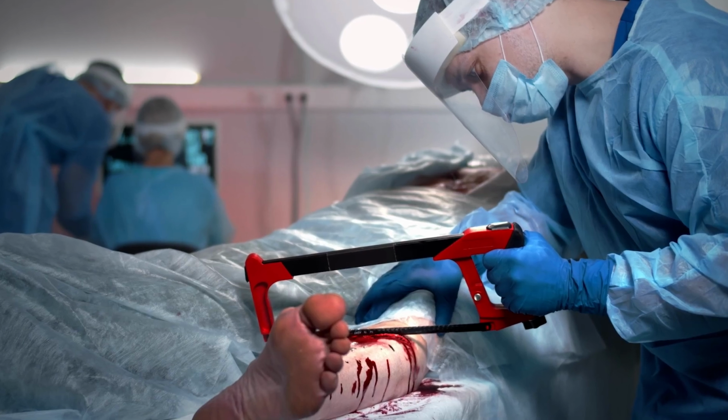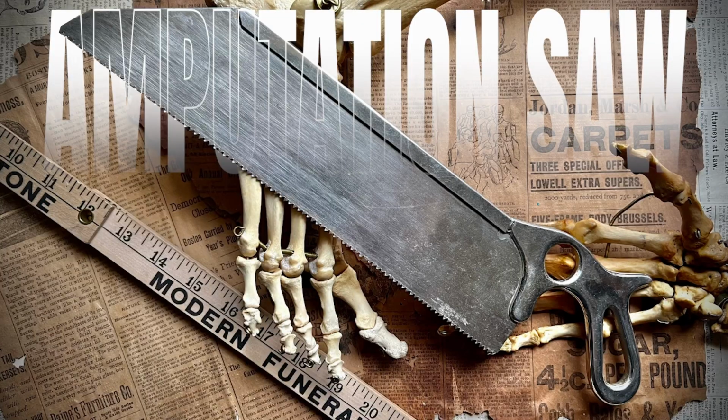The trusty old amputation saw. Believe it or not, this saw is still frequently used today. A lot of times, doctors will use power equipment, but I've been in many general surgery cases with surgeons who don't regularly use power tools, so they stick to the basics, using this tried and true limb cutter. The sound inside the OR is surreal.